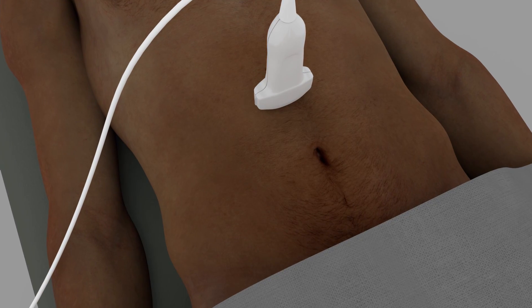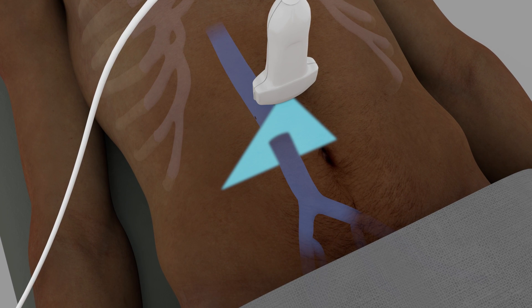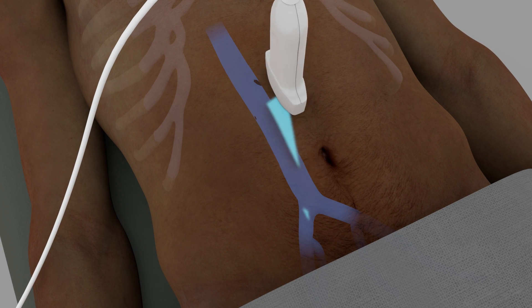Once the transverse view has been obtained, center the probe over the IVC and rotate it 90 degrees clockwise to obtain a longitudinal view of the IVC. The goal is to align the ultrasound beam parallel to the long axis of the IVC. Adjust the gain and depth to obtain the best possible image.